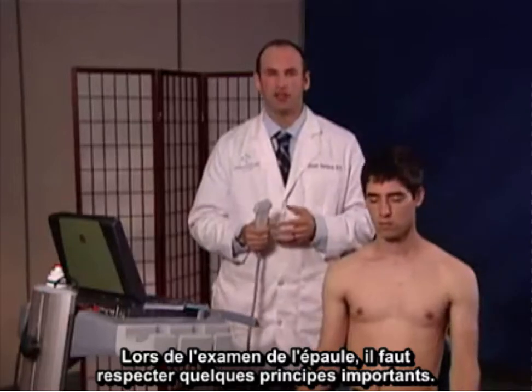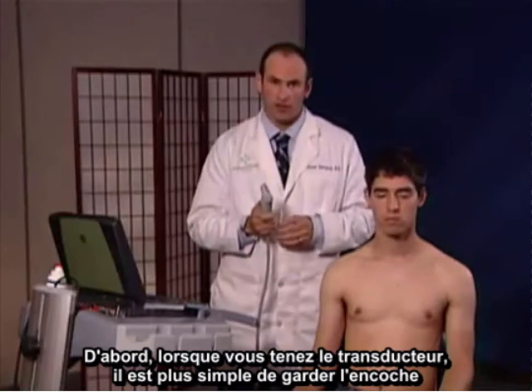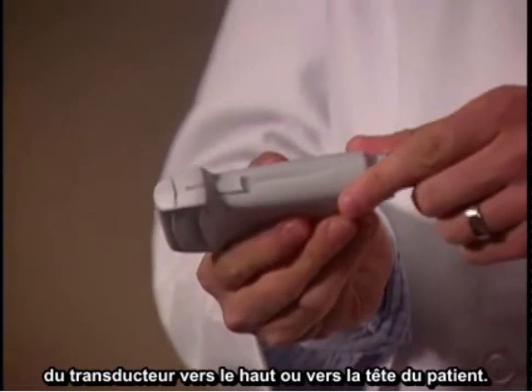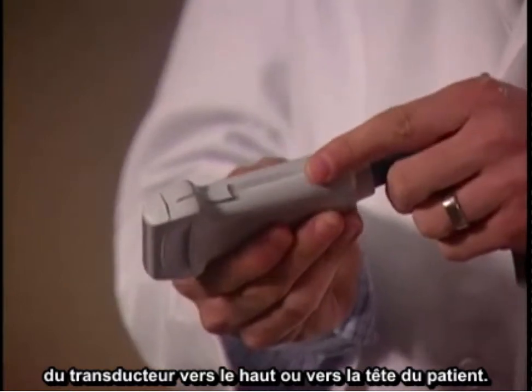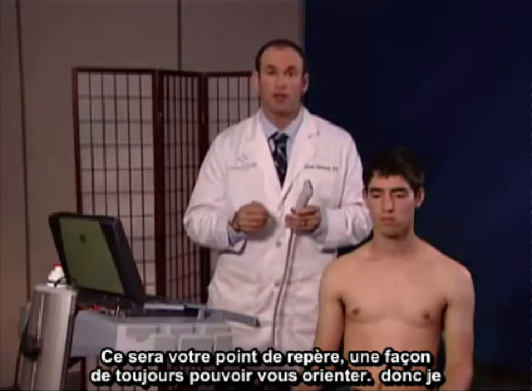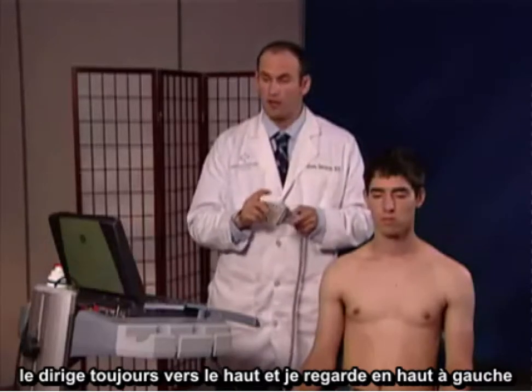In examining the shoulder, there are some important principles to follow. First of all, when holding the transducer, it's easiest to have the notch of the transducer always facing upwards or cephalad on the patient. That will always be your lighthouse, so to speak, of exactly where you are. So I always keep the notch upward as well as looking at the upper left-hand corner of the screen to make sure I know exactly where I am.